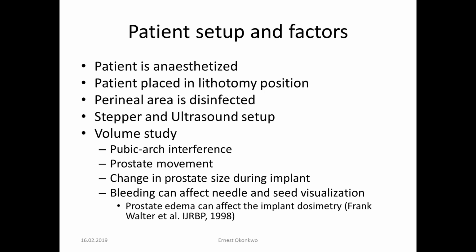Volume study, you want to make sure that there's no pubic arc interference. You have to take care of prostate movement. I'll also show that what we do with that is that we try to insert the first needles at 9 o'clock and at 3 o'clock in order to hold the prostate in position. And when we are also loading the seeds, we start with 9 o'clock and move to 3 o'clock, and then come back to 9 o'clock and continue downwards.